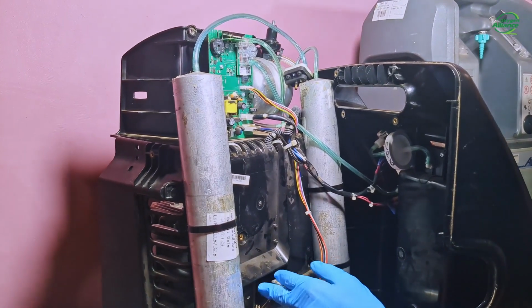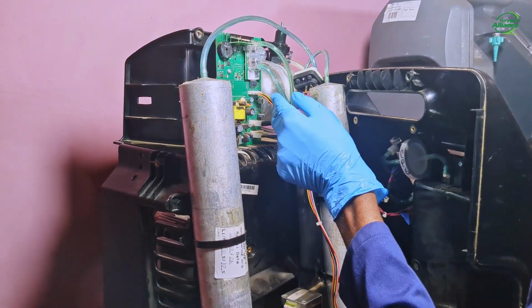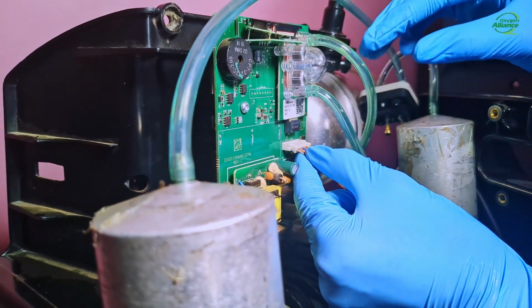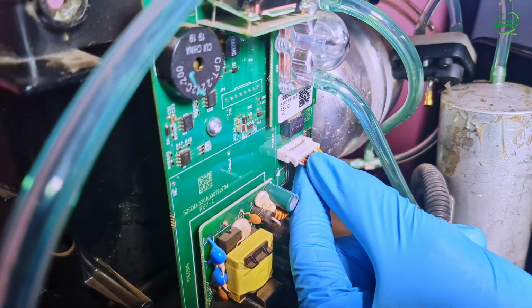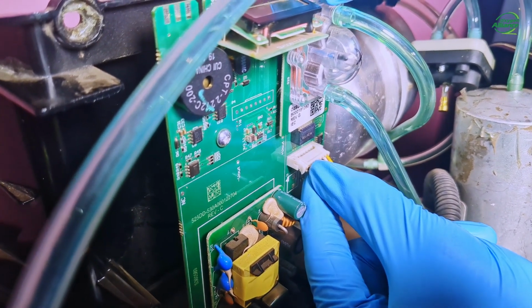After checking the wire connection on the valve, I will also check the wire connection on the board. I will just check here to see if it's connected properly. As you can see, it's loose. So I will just make sure that it's properly connected on the board. I will push it.